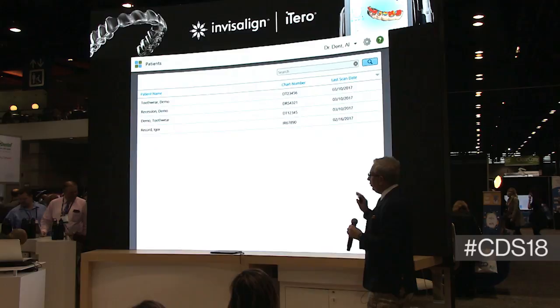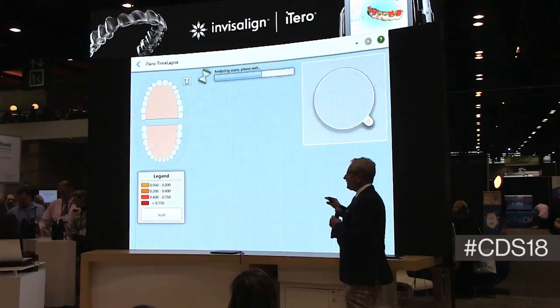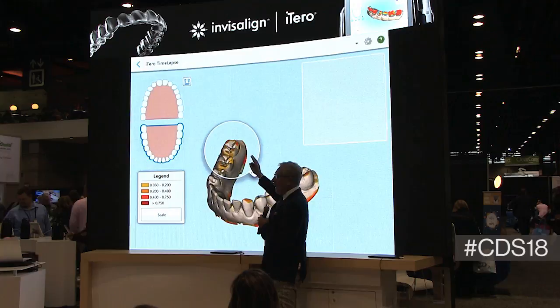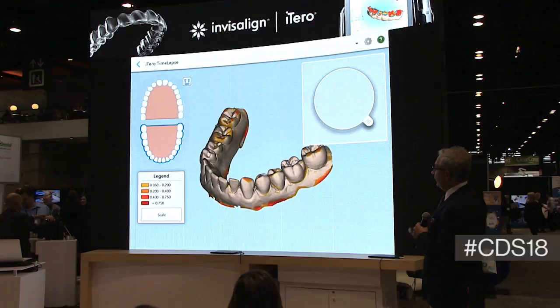So let me kind of show you how time-lapse is another cool software here. So what we're going to do is basically scan a patient and in 6 months or a year, rescan them. And what we're absolutely going to be able to do is look at tooth wear. So if a patient denies grinding, it will be totally possible to look at this and go, I can now see grinding. So before and after in 1 year. And this is the time lapse that they're now offering.